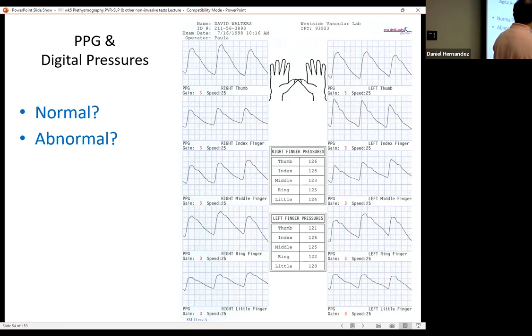This finger's not too bad. Thumb's not so bad. Not as bad as these. So the middle finger, definitely not, because that notch is high. It looks like the index is starting to get affected too. Interesting, because for the right index finger, the notch is high to me, not as high as the middle finger.